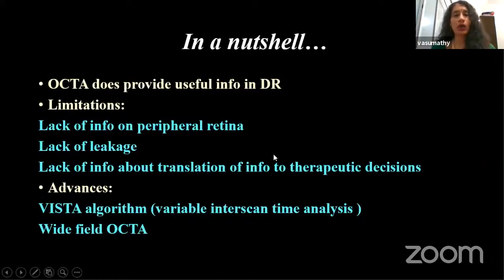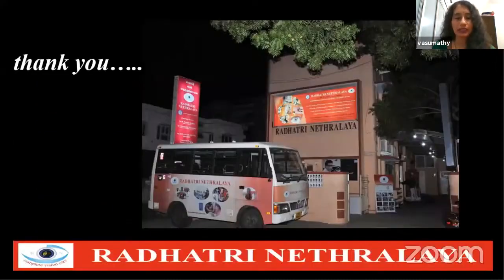So in a nutshell, OCTA does provide useful information, but the limitations are, of course, that at present we don't have information on the peripheral retina. We don't have information on leakage, and we don't know how to translate whatever information we have into therapeutic decisions. We are waiting for the VISTA algorithm and wide-field OCTA to be widely available, for us to make use of this beautiful armamentarium more fruitfully in our management of diabetic macular edema.